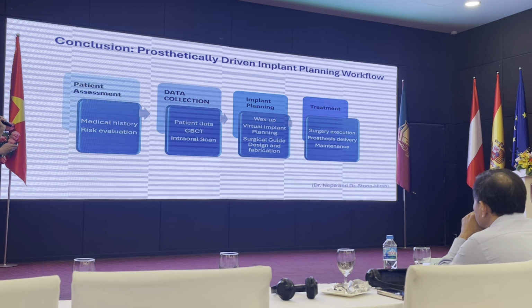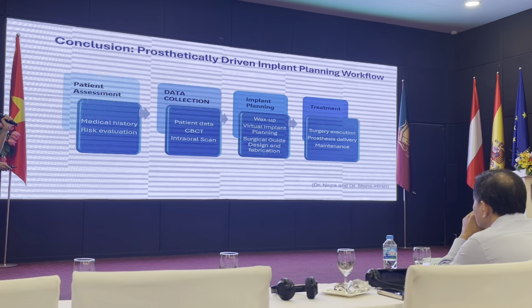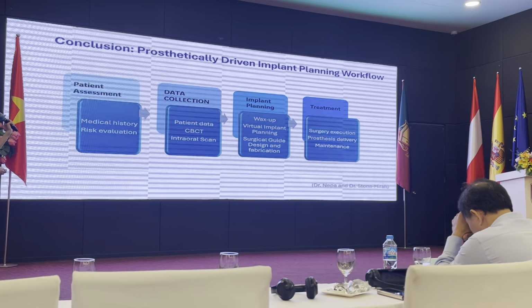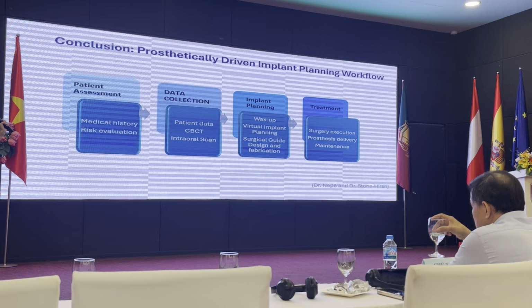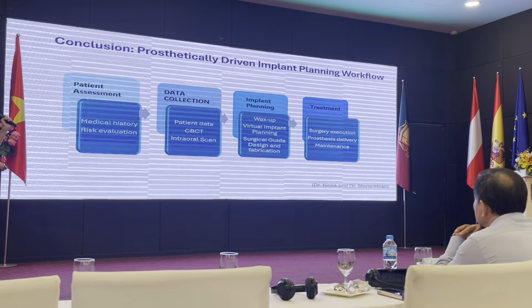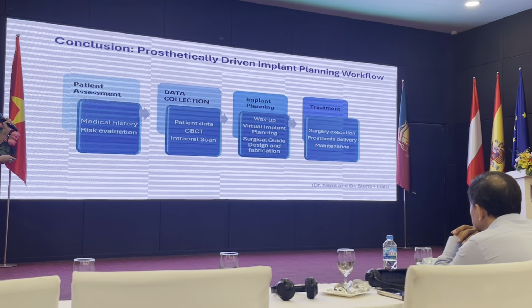And conclusion, I think it goes back to how we started. So before we do any implant surgery, we don't want to just jump in and place the dental implants. You want to have a careful planning that is multidisciplinary. So first, case selection. You want to go through all the medical history. And just like how we build a house, you want to build the foundation first and treat the active disease before you do anything. And for data collection, right now we have so much digital tool, not just CBCT or intraoral scan. Right now in our school, we have been trying to integrate with the facial scan and also a digital smile design as well.